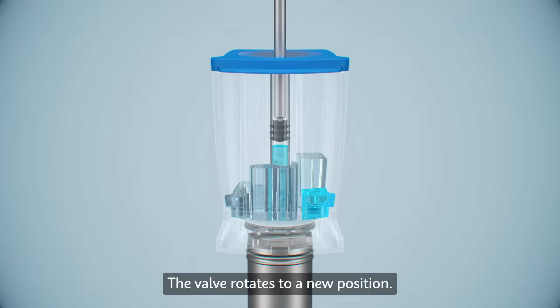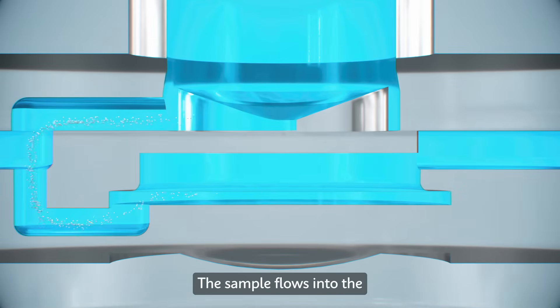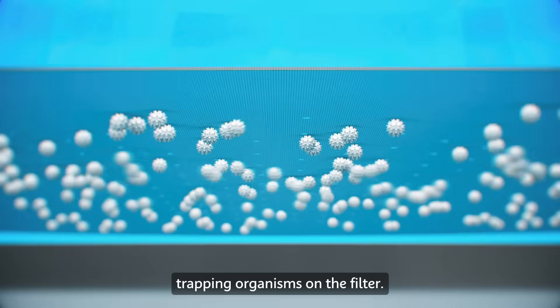The valve rotates to a new position. The plunger lowers, pushing the sample into the active area. The sample flows into the active area and through the filter, trapping organisms on the filter.